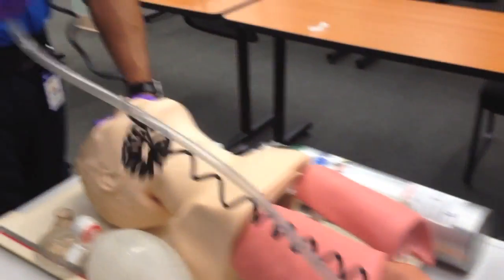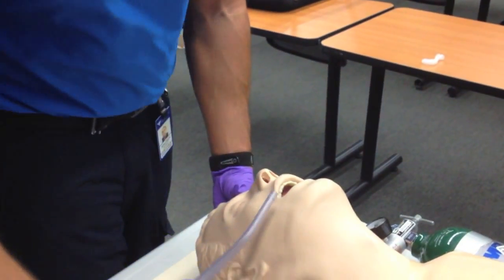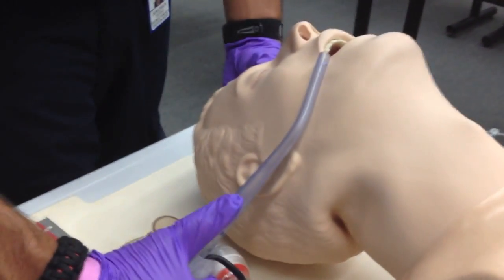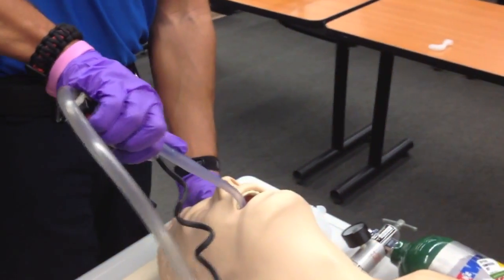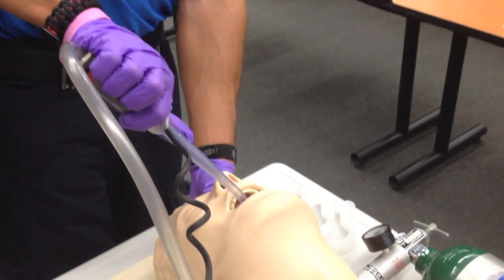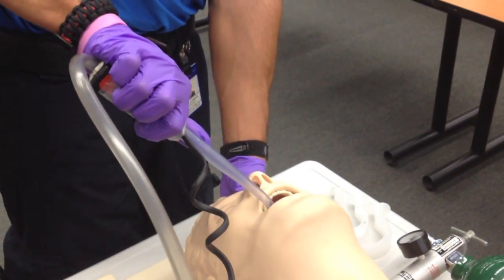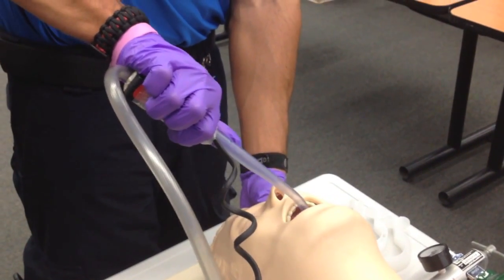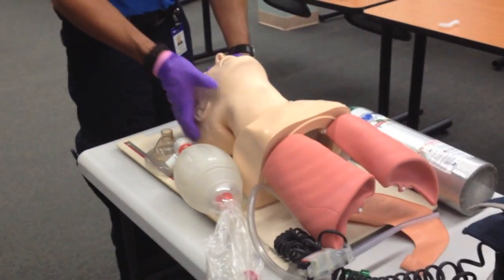I'm going to prepare my rigid tip suction, making sure I cover the catheter when suctioning. I'm going to measure from the corner of the mouth to the earlobe to determine insertion depth. I'll insert the catheter with the suction off, then suction in a circular motion only as far as I can see, on the way out, for no longer than 15 seconds. The mouth and oropharynx are now clear.